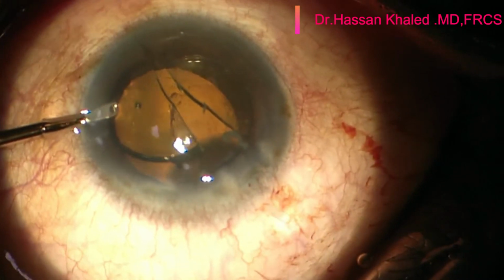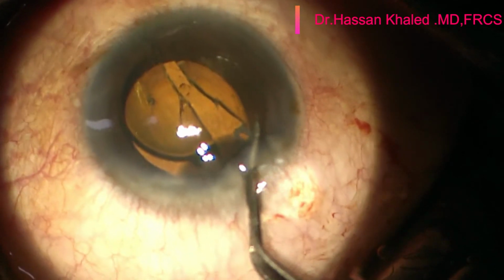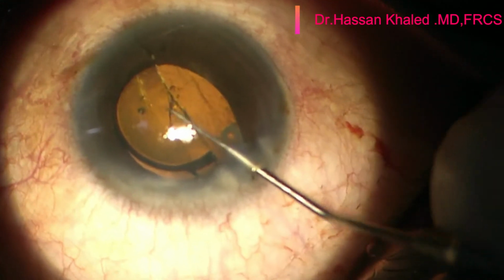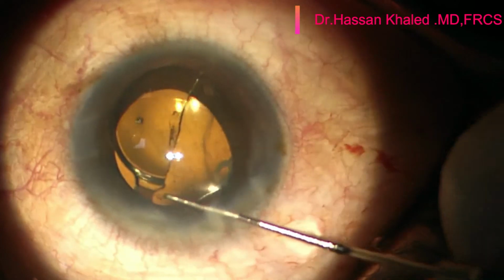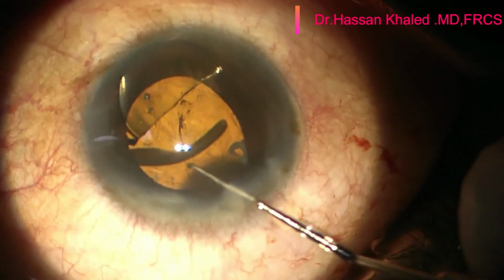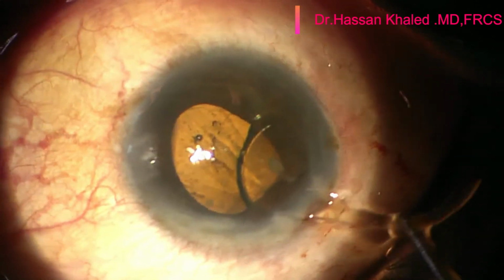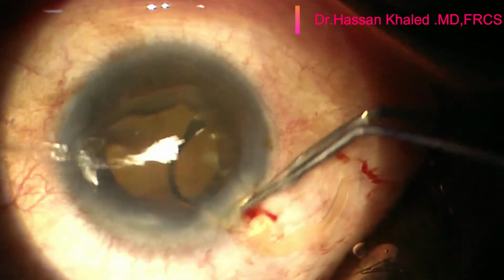Now two halves are ready to be removed from the anterior chamber using any forceps to remove each half alone. Now this first half is out of the anterior chamber, and now repositioning the second half to hold the haptic and to get it out from the chamber. To get the haptic first, then you can pull it gently and take it out from the anterior chamber.